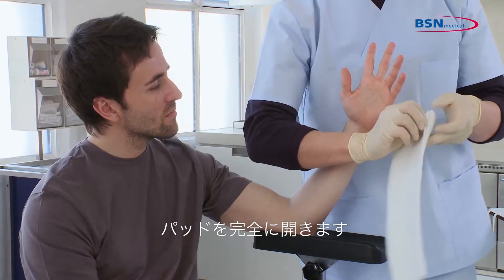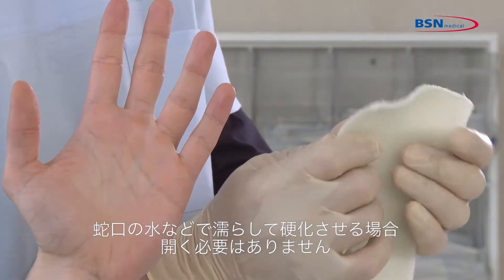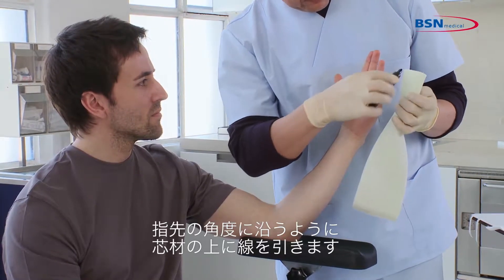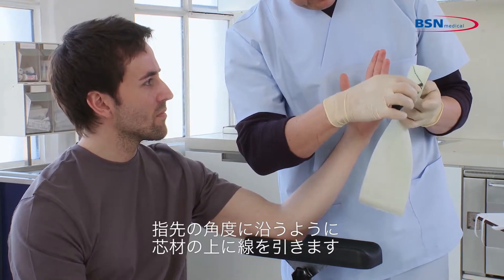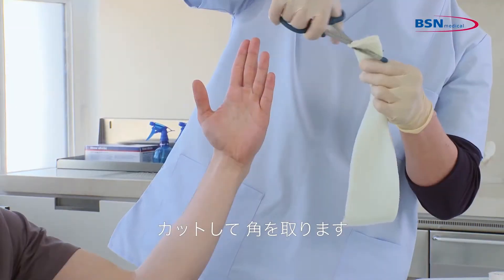You can open the padding completely. If you use a bucket of water or faucet for water activation, you do not need to open it. Fold the substrate lengthwise and mark a line on the substrate following the patient's fingertip angle. Round the edges.